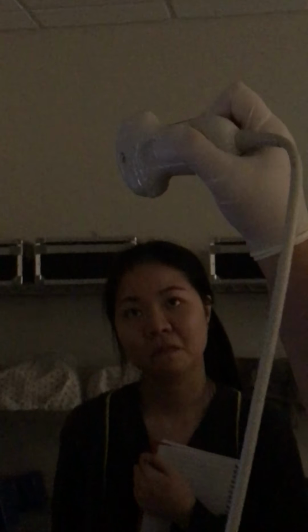Literally, from the first picture I take, it's first picture, second picture, third picture, fourth picture. And then twist. And then I slid down a little, fifth picture, sixth picture, seventh picture, and then down to liver and kidney.